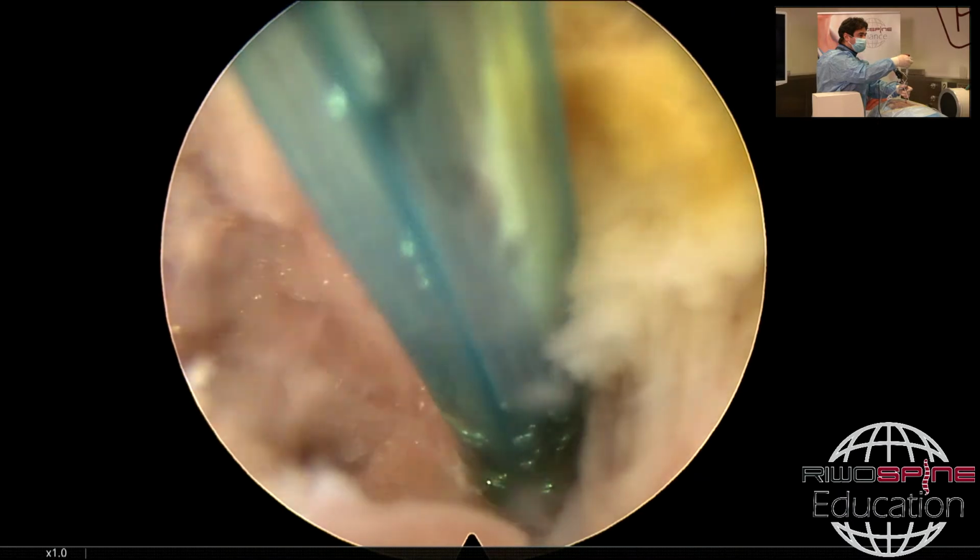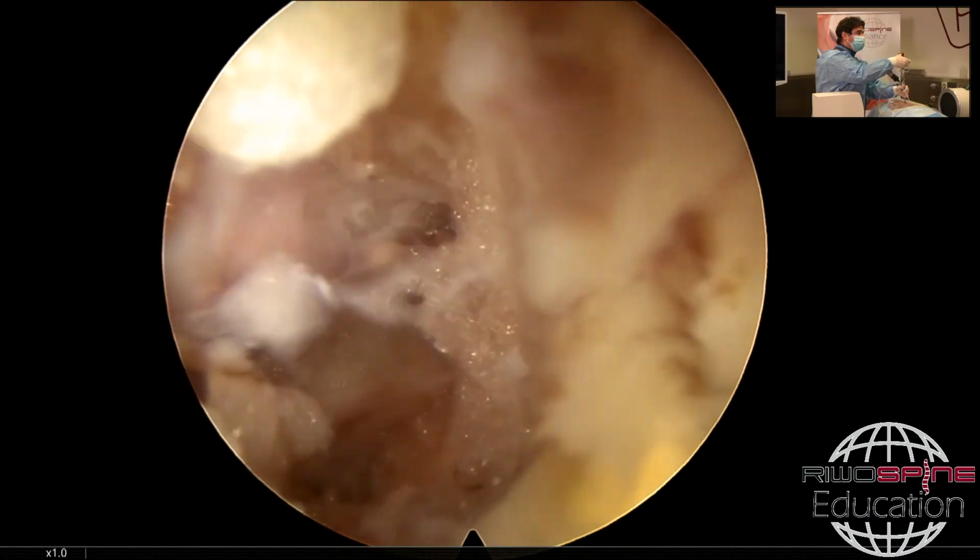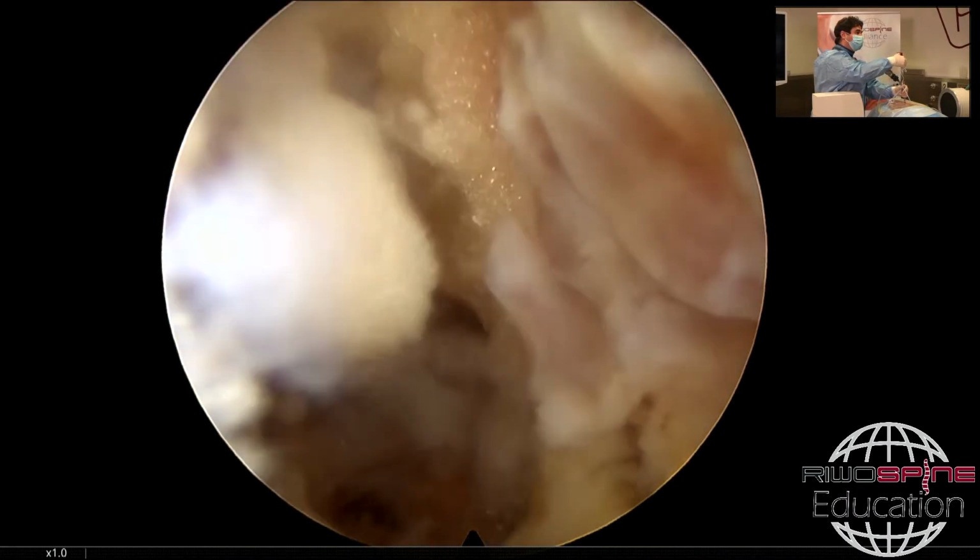Okay, I start to see something, but I just want to know what they are and explore more.